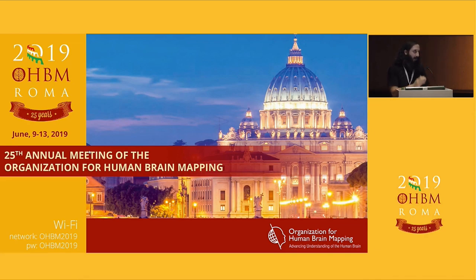What we have seen, though, with the MP2RAGE acquisition, which has a lot of advantages in terms of bias correction, is that the MP2RAGE acquisition does cause some biases in the placement of the surfaces, partly due to the fact that the image reconstruction is nonlinear.